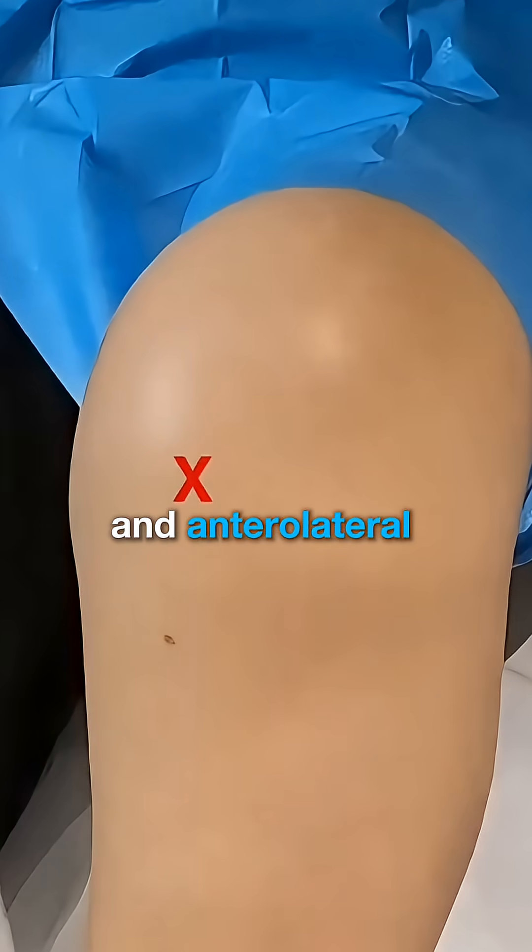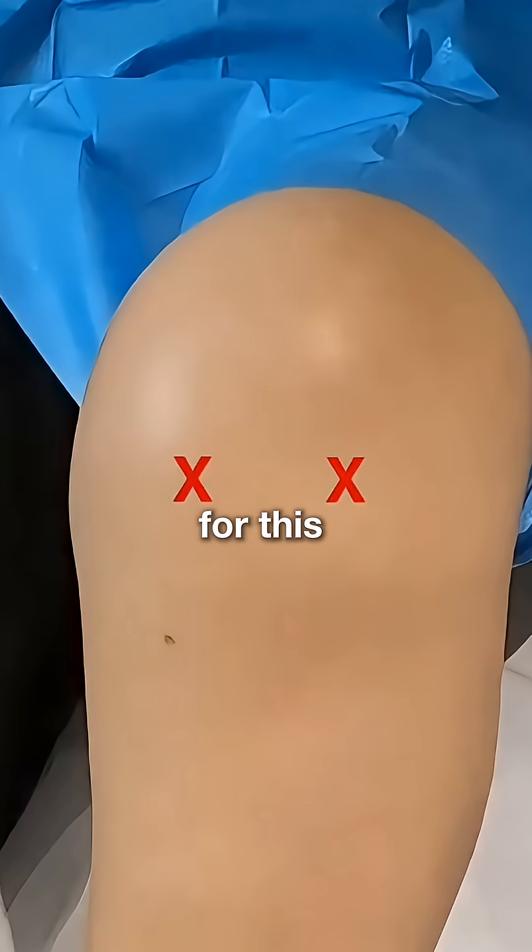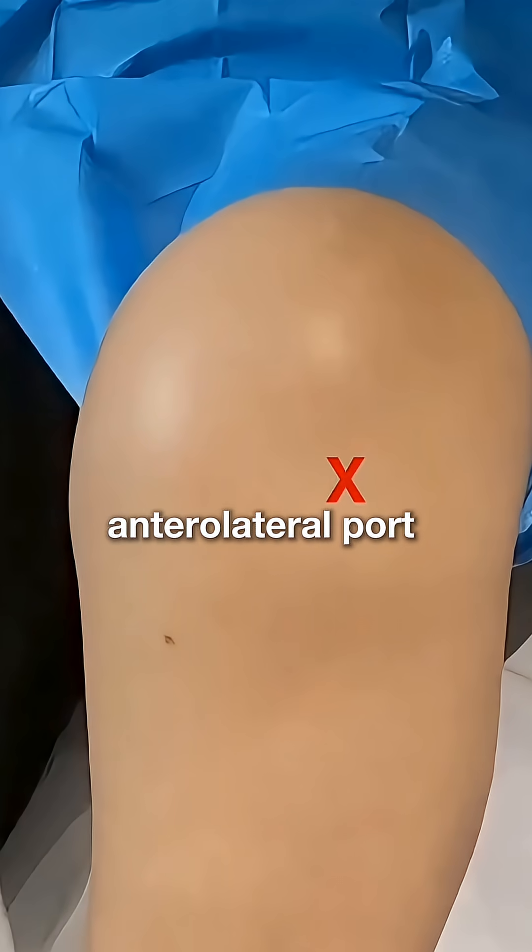Both the anteromedial and anterolateral sites can be used for this injection, but the anterolateral port is preferred as this avoids the ACL.